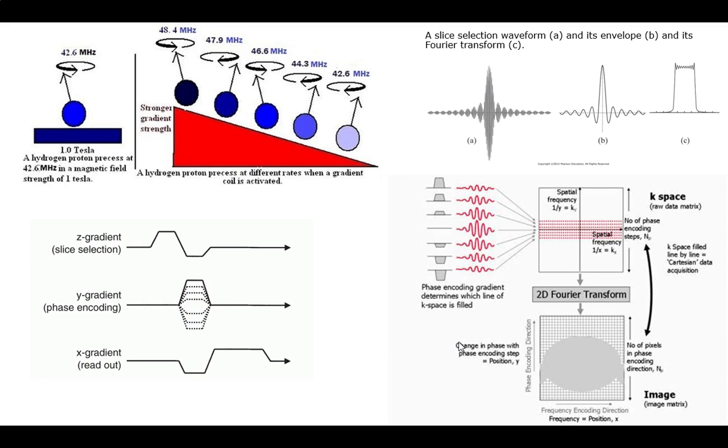You do an FFT on the initial one that fills up your K space, and you write that K space line in, and then you'll do an inverse FFT once you've filled the whole K space. But you're going to do a line-by-line read, and you separate out the left to right. That's why this has to be constant over the whole time you're doing the readout, because you're really just holding the frequencies a little bit out of where they want to be, so that you get a spatial encoding. So you could go, oh, the slightly faster ones are on the right, the slightly slower ones on the left, and there you go. Does that make more sense?